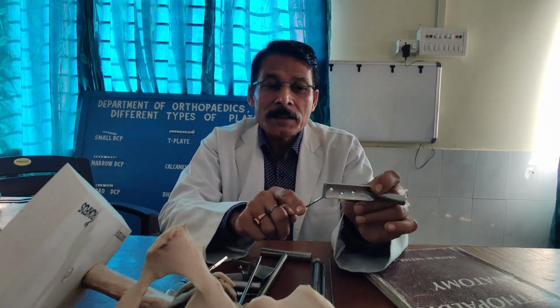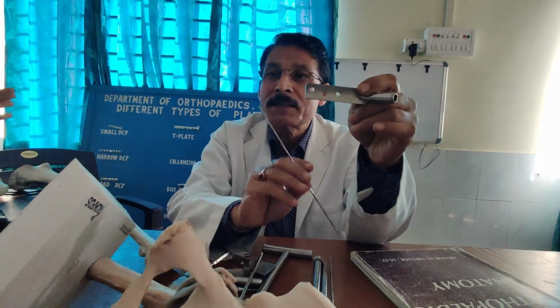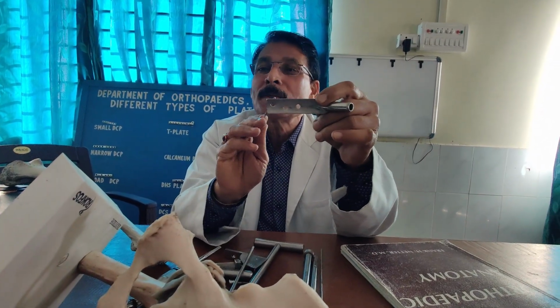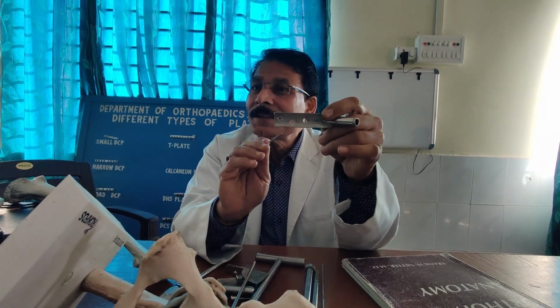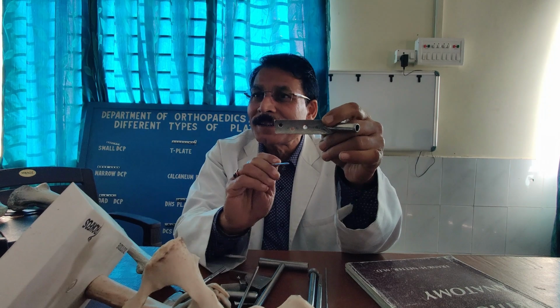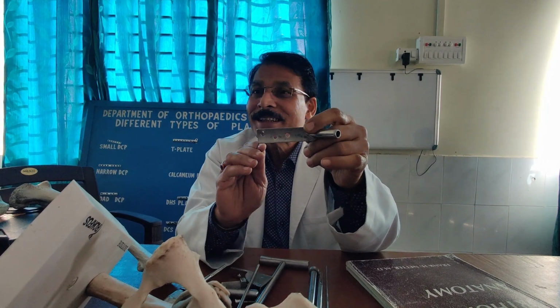Flexor side. Got my point? One point. Additional point, again an interesting point: see, the holes are not the same length. Why? If they are the same length, there is a stress riser. So they are staggered, coming like this. See, they are not the same.